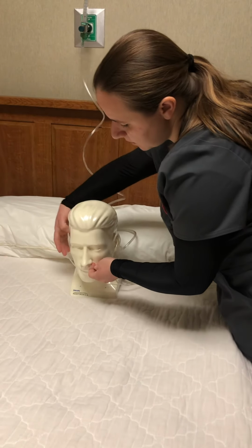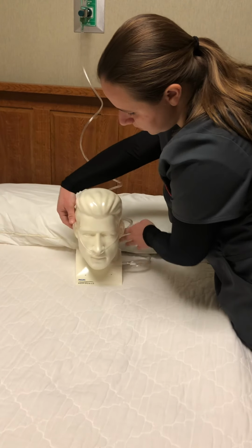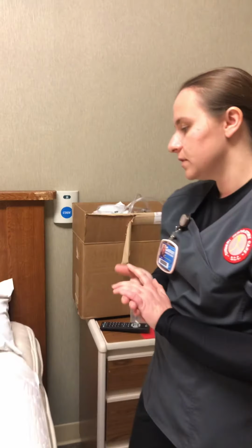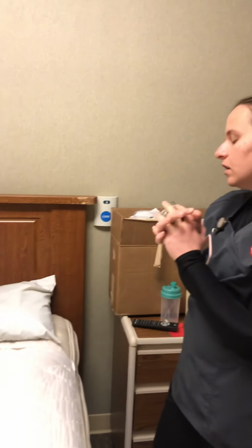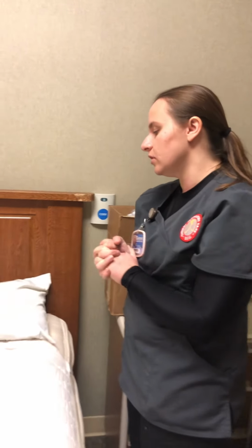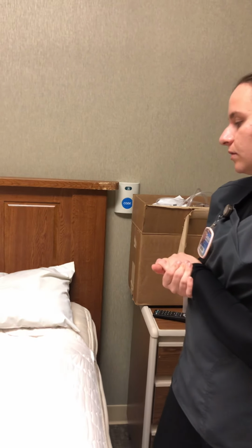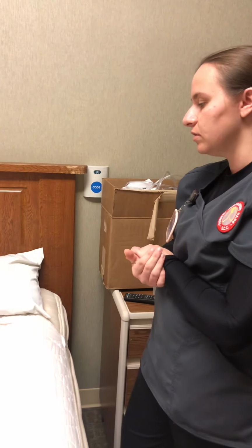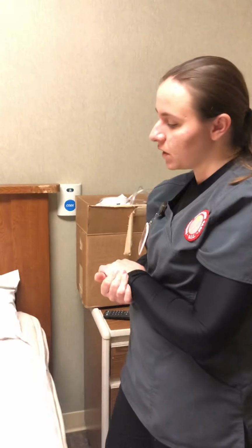Anyways, so we place it into their nose. The prongs would be facing down like that, just so that way it stays in their nose. Okay. Alright, so please don't move it. Don't put any Vaseline. If you get any dryness, don't put that in your nose because it can cause combustion. The one thing I ask is that you don't move it off your ears because that will get sores behind your ears. And then the other thing is if you do get too much dryness, I can always add some humidification onto it. But for right now, we'll keep you on that and see how you do with that.